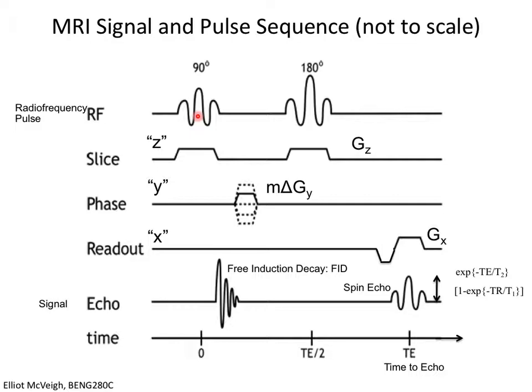Down to the feet, a lower frequency because of the gradient. So it's that spatial distribution of the magnetic field that I've changed in a very controlled way that gives me slice selection. Already, after applying this gradient during the RF pulse, I have selected a chunk of the patient that I'm going to get signal from, and it's the slice.